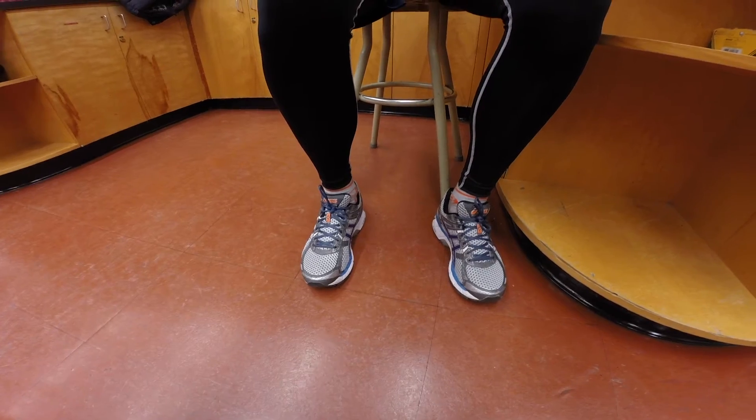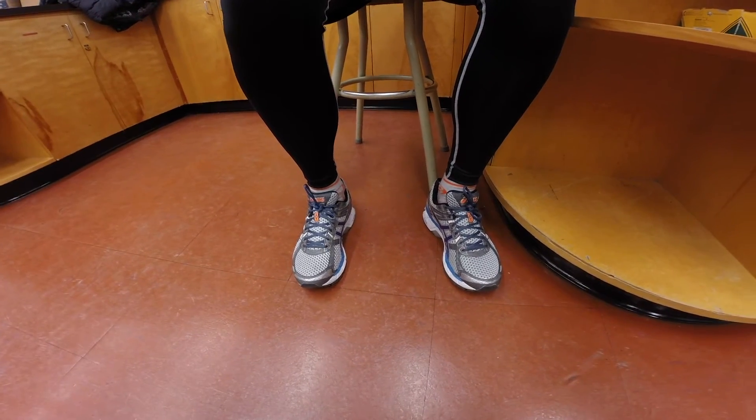First, make sure they've been sitting down with their legs uncrossed for at least 5 minutes. It's best to do this right after taking their heart rate.